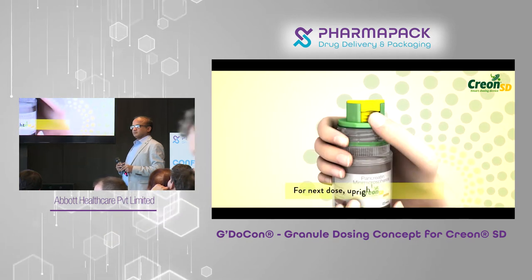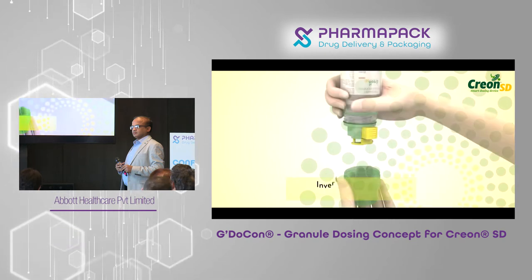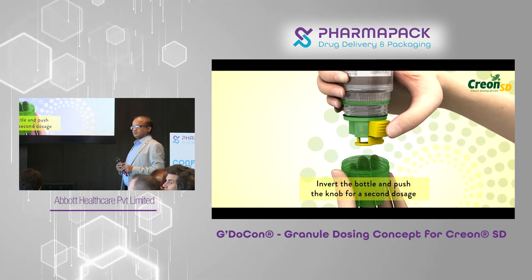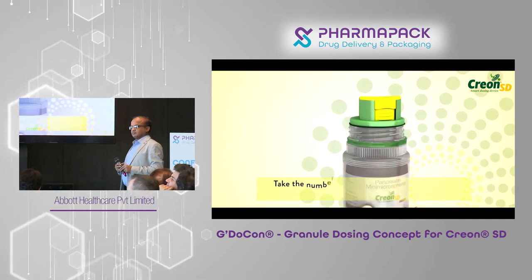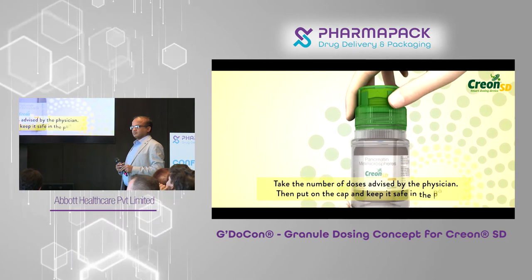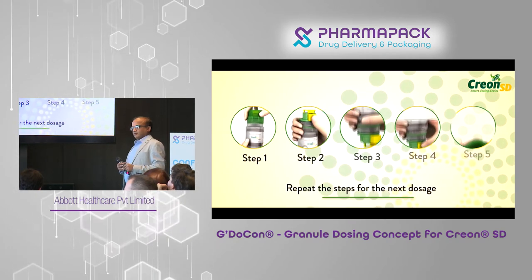For the next dose, again, upright the bottle. Invert the bottle and push the knob for a second dosage. Take the number of doses advised by the physician, then put on the cap and keep safe in the pouch. Repeat the steps for the next dosage.